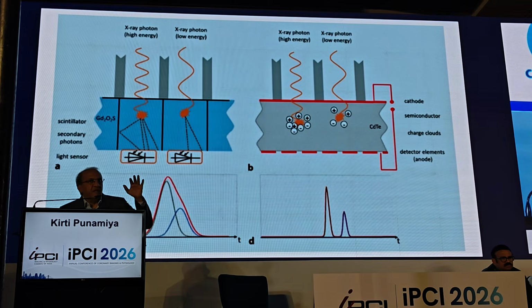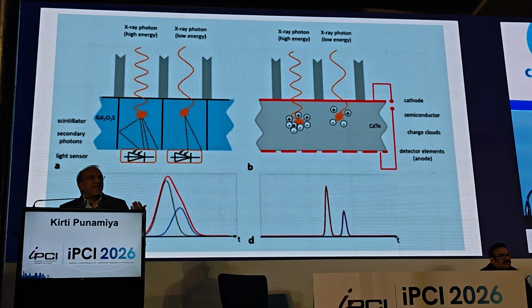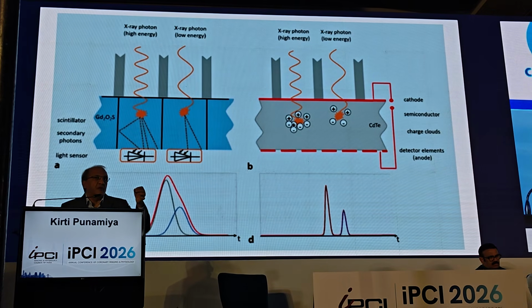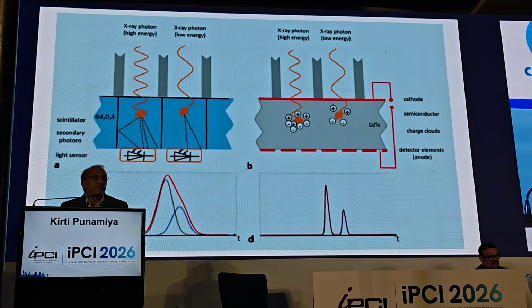And X-rays, when they fall on cadmium crystals, convert to an electrical impulse, which is direct. And that is what is photon counting. So each photon will actually generate one image, so that's the pixel.